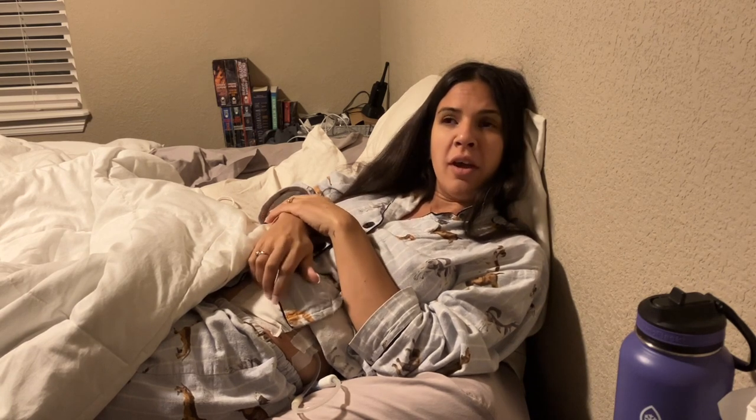Alrighty, here we go. I'm in bed now and Richard is about to do what's called exit site care. You guys are about to see some stuff that might gross you out — I'm sorry if you don't want to see my open wound and my catheter, but you're about to. So if you don't like it, make sure you click off or close your eyes. But I'm going to show you dialysis real life right now because, guys, it's real. Richard had to wash his hands for two minutes. He just did that.